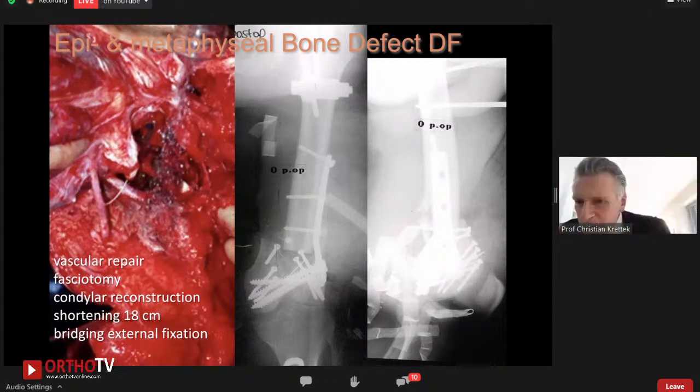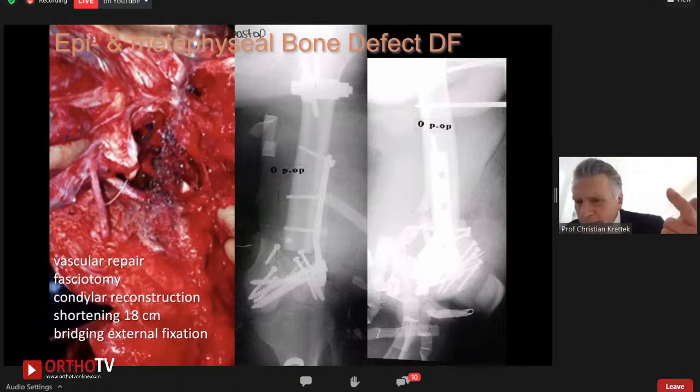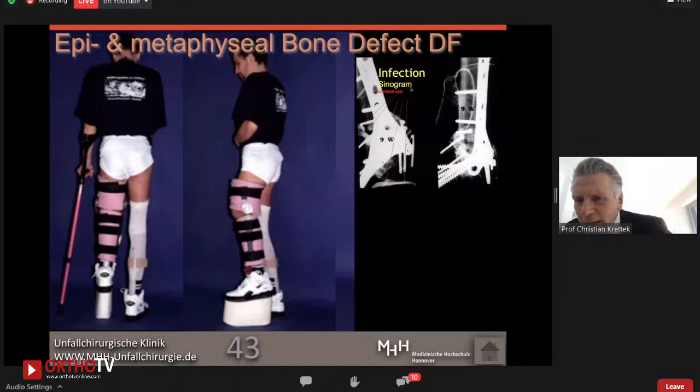Yes, but the question is, does it make sense? And how long does it take? And is it worthwhile? And the other problem, there was significant ligamentous instability. You saw this very short distal shelf. So we had ligament instability, we had shortening, we had infection. You see here, after 9 weeks, relatively late, we had a positive sinogram. That's how we mobilized him with this huge walker. And after 9 weeks, we had this infection problem. So the question to the faculty is, what should we do now?